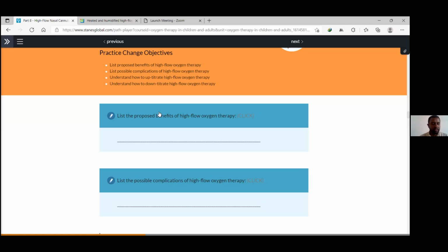Okay. So Mariam said dry nose, dry throat, and Tensai said pneumothorax, epistaxis. Okay. Irsal said epistaxis, gastric distension. Excellent.